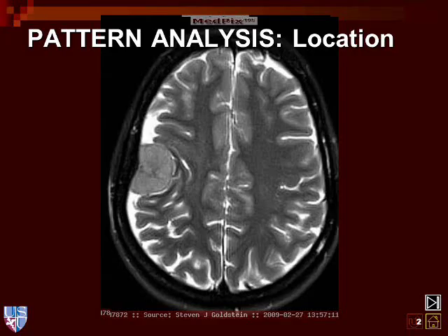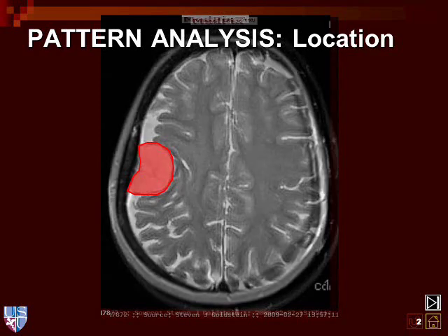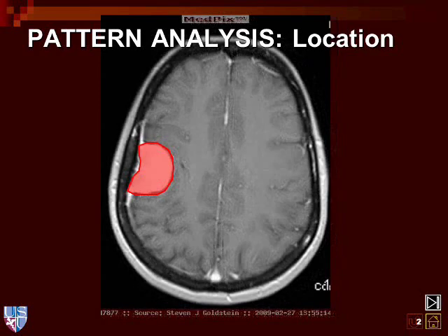In this axial T2-weighted MR scan, there is an obvious abnormality that can be seen on the left side of the image, which is the patient's right side. This mass lesion is also associated with some underlying thickening of the skull, or hyperostosis. We can see that this lesion is extra-axial — it is pushing the brain out of the way and pushing the brain away from the inner table of the skull.